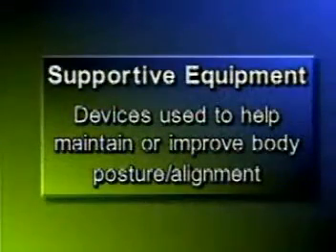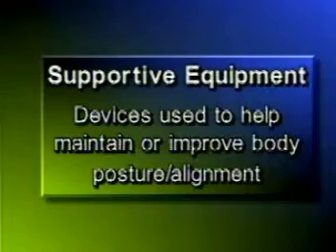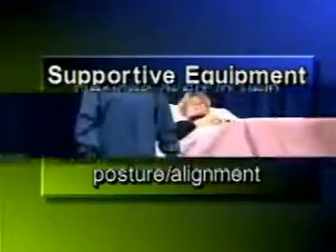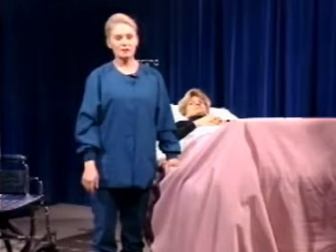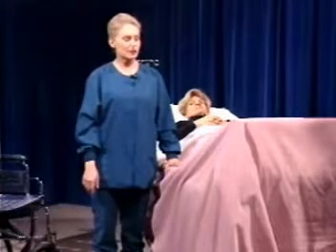Supportive equipment are devices used to help maintain or improve body posture or alignment. Let's now turn our attention to supportive bed equipment. The first piece that we'll be looking at today is a blanket cradle.